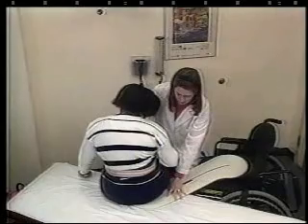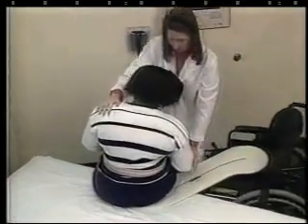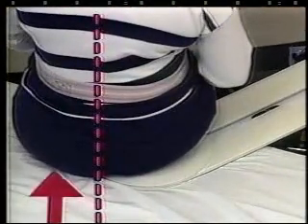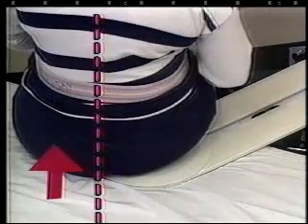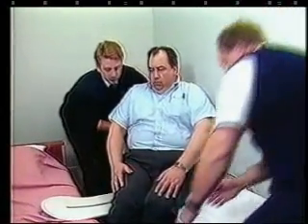In fact, the larger patients, you may want to put part of the buttocks behind the seat and lift them a little. We affectionately call this one a one-bun transfer. Don't worry about the weight. The Beasy can handle it. And as you know, our larger patients must be transferred too.